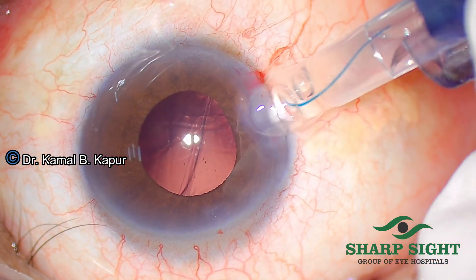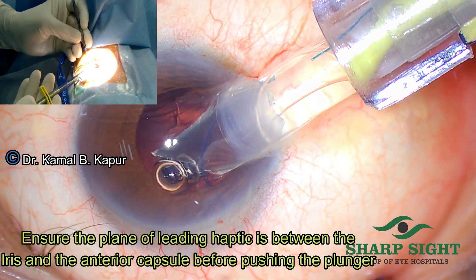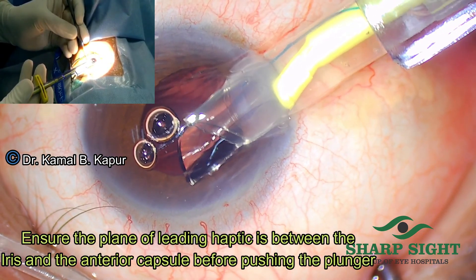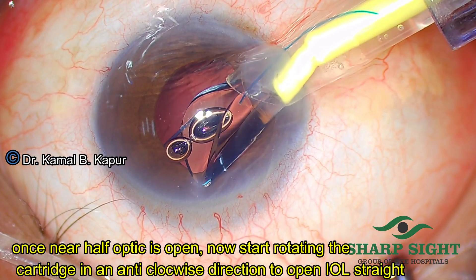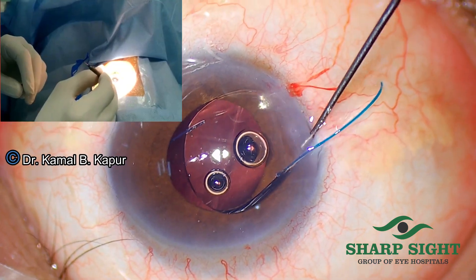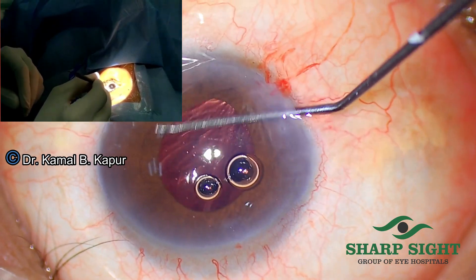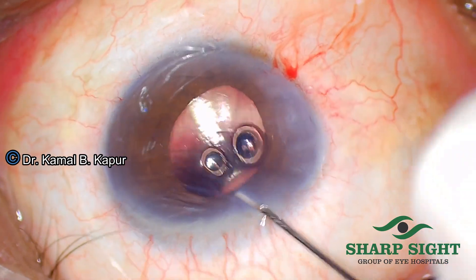We enter the wound straight inside with the bevel downwards, and once we are in, we slowly turn our hand in the clockwise direction making the bevel face the left side and start injecting. We make sure that the leading loop is coming behind the iris and keep injecting until nearly half the optic has opened. Once done, we start rotating our hand in the anti-clockwise direction and slowly withdraw the cartridge out of the wound. This leaves the trailing haptic outside the wound, which can now be dialed very comfortably into the eye in just the position behind the iris. You can do the same step using McPherson's forceps.